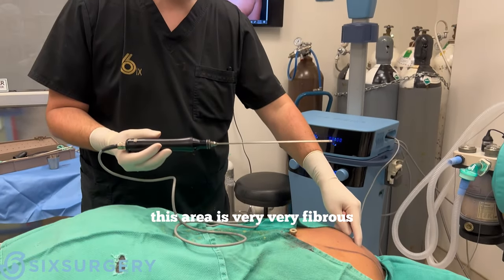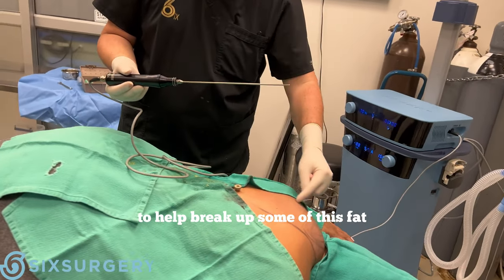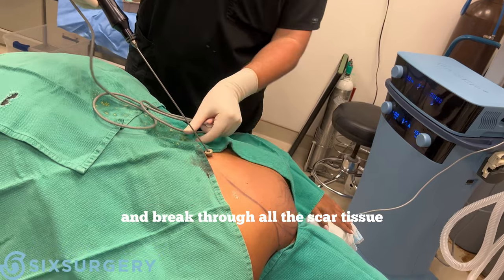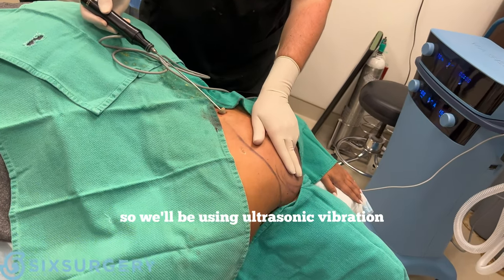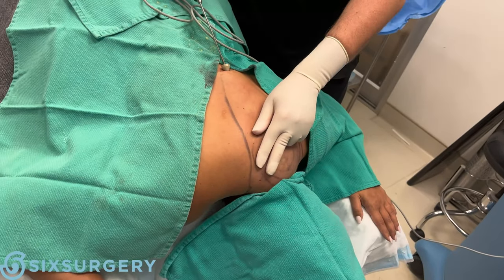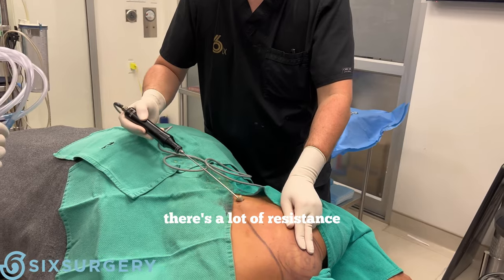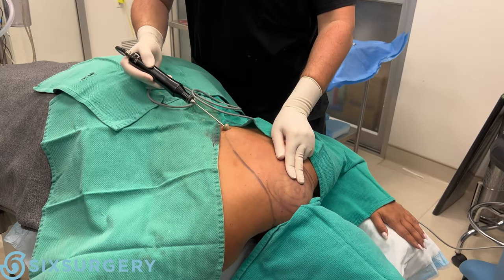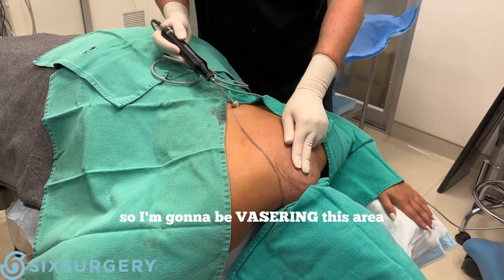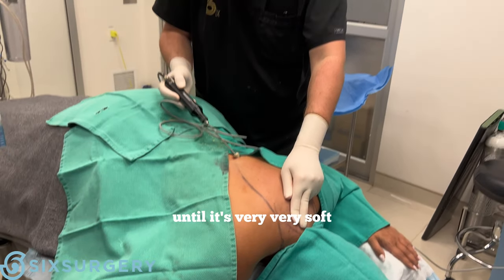This area is very fibrous and can be difficult with liposuction, so I'm going to use VASER to help break up some of this fat and break through all the scar tissue. We'll be using ultrasonic vibration to break through all this. There's a lot of resistance. I'm going to be VASERing this area until there's no resistance and it's very, very soft.